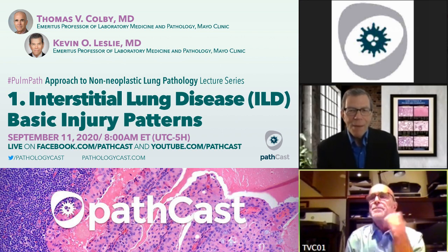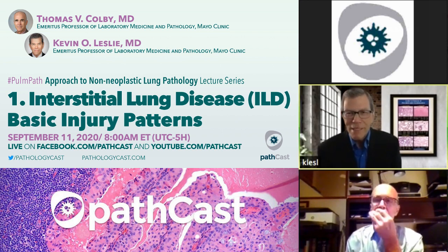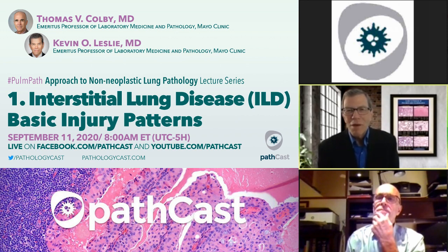Agree. You may be compelled to do it. You may have no choice because you can have a cancer and you can also have acute injury. But when they're mixed together, more likely than not, it's going to be a reactive atypia that's fooling you. So back off at least 1 degree on your cancer diagnosis when there is associated acute injury.